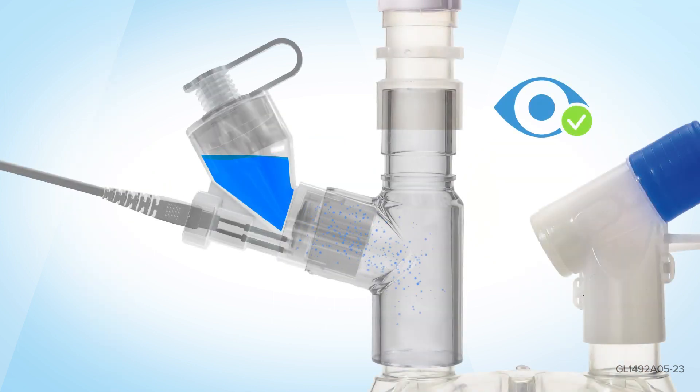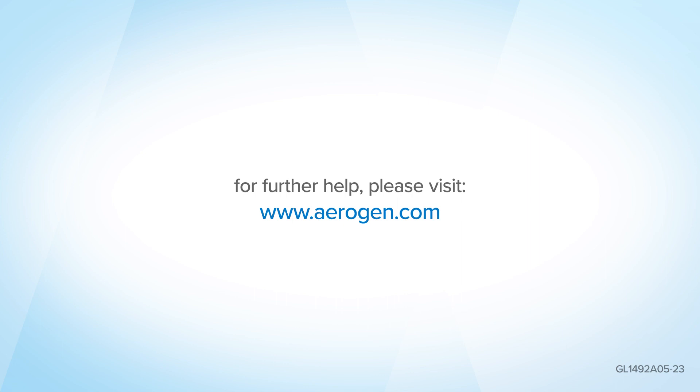Visually check that aerosol is being produced. For further help, please visit us at aerogen.com.